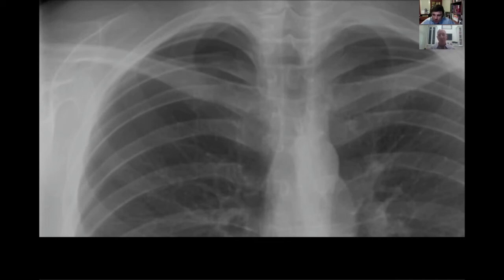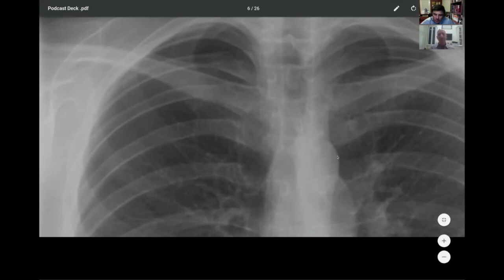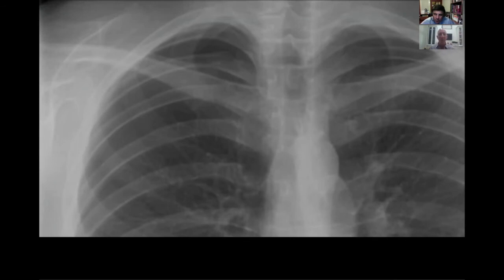It's a lot of very active manipulation of the image presentation during the review process, and that's super important. So you have to make sure that you're doing that on every case, really magging up and zooming and panning. It's a very active kind of search process. And as long as you're doing that, you don't need any more tricks. These things will be visible.